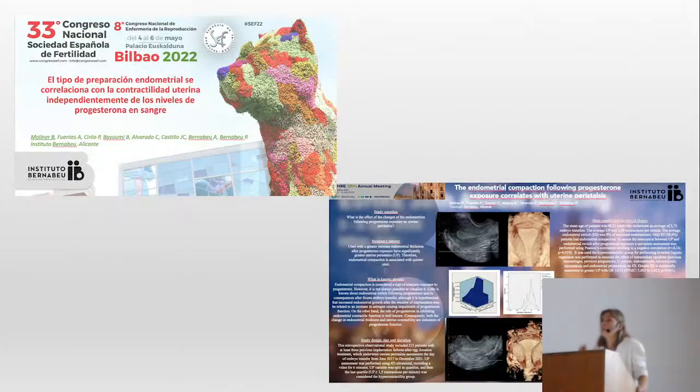All right, so we have already more than 500 patients recorded in our database, but here we assessed around 250 or 260. Our interest now was that we know that the majority of our patients with contractions have low progesterone levels, but what happens in the others? So we were looking for other markers to see what the problem is, why this hypercontractility is not related to progesterone.